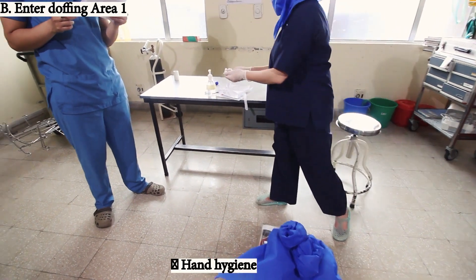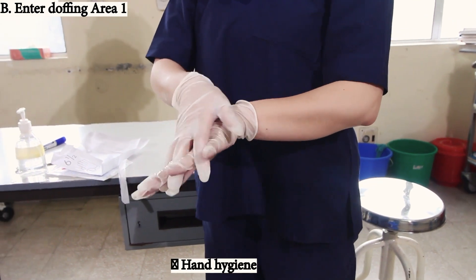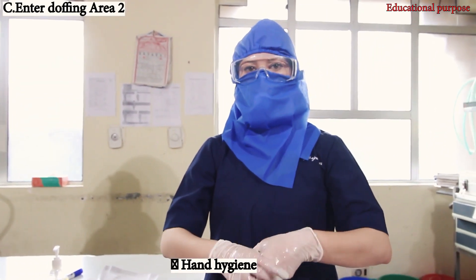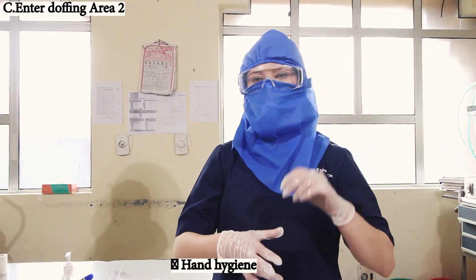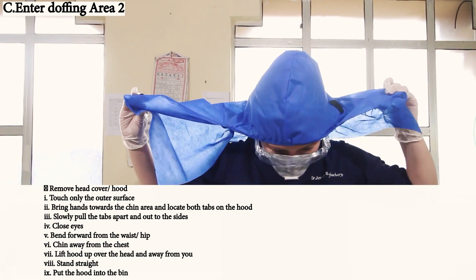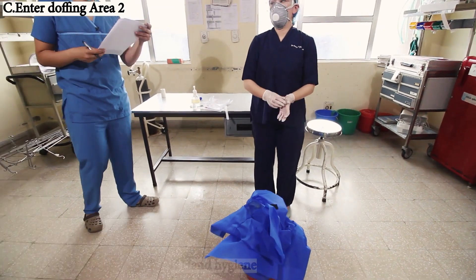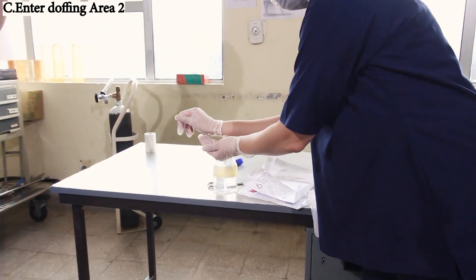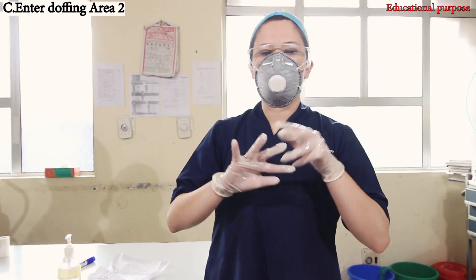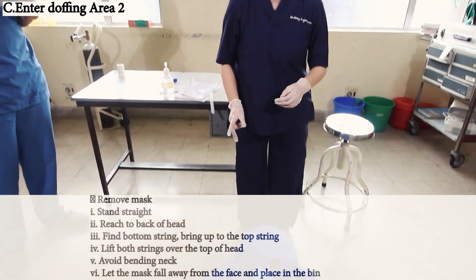Hand hygiene again. This completes doffing in Area 1. Now we enter Area 2 where we again perform hand hygiene and remove the head cover or hood. Touch only the outer surface, bring hands toward the chin, locate both tabs, slowly pull the tabs apart. Close eyes, bend forward with chin away from the chest, and put it in the bin.